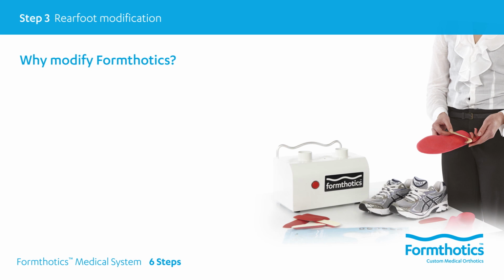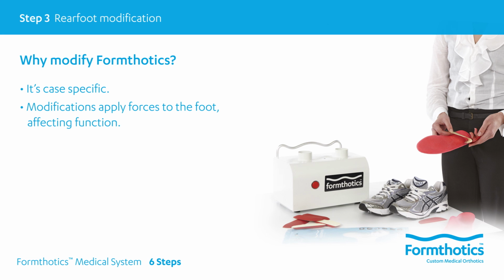There are lots of reasons to adjust Formthotics. It is a customization process where the orthoses are made to best fit the patient, facilitate better function, and provide the best support for their pathology to reduce their symptoms. The adjustments are usually placements of wedges or additions to the underside of Formthotics. The wedges may be applied medially or laterally.